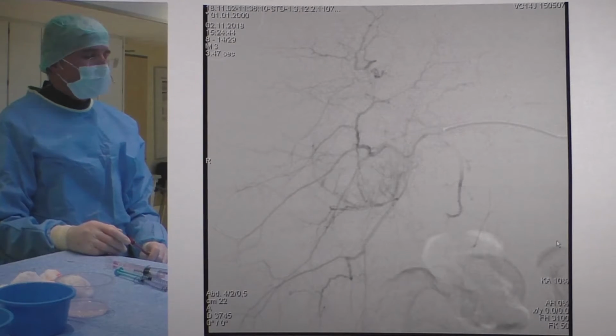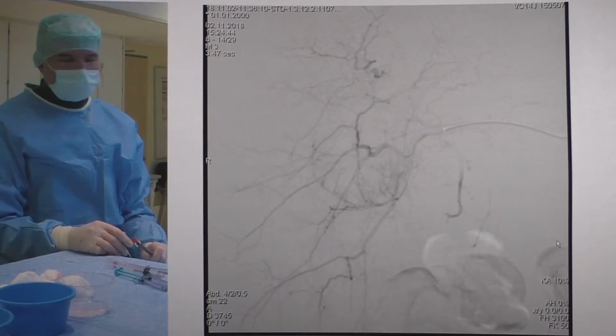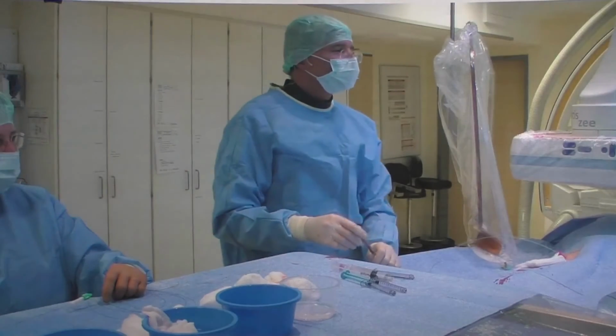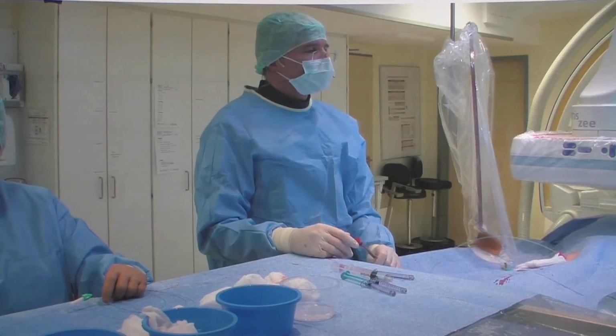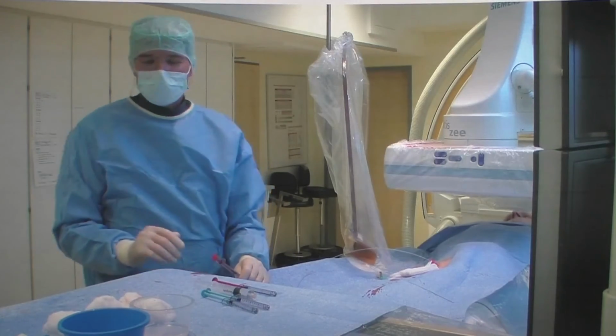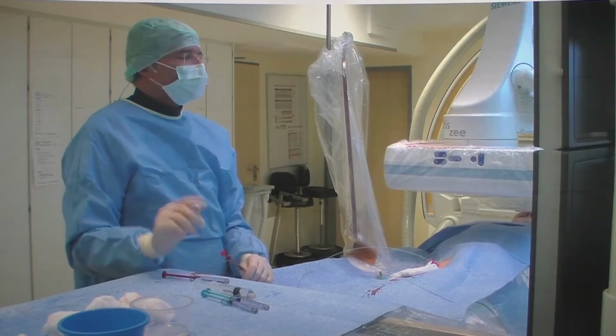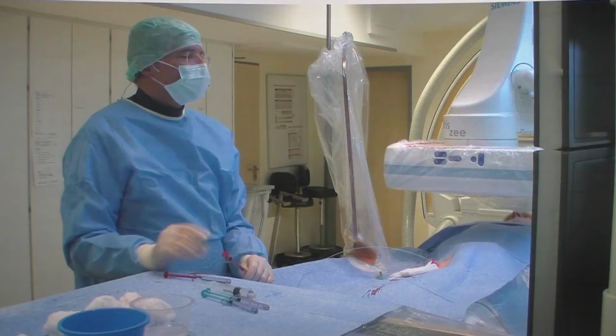Do I have more time? Yeah, just continue, and we're not going to continue watching, but we will switch back to your operating theatre later to show us the results of his intervention. Mr. Fischbach.